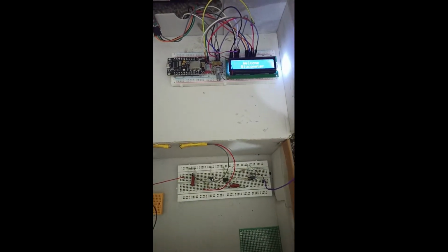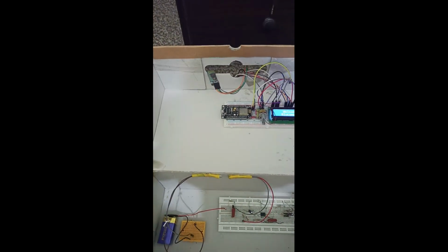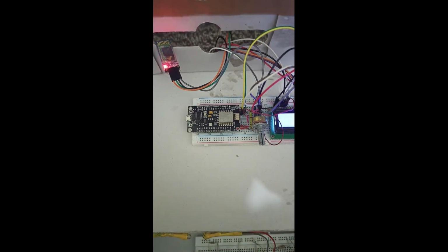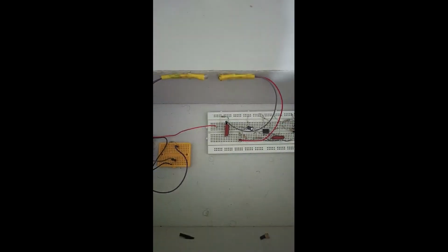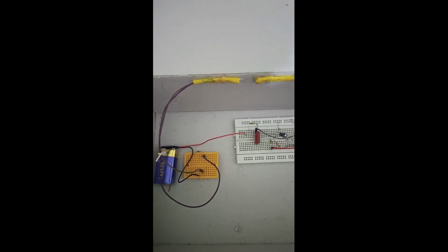Hi, this is the hardware circuitry of our project, powered up with a laptop. The main components of our project include the Wi-Fi based NodeMCU microcontroller chip, an LCD along with it which displays the data sent by the app, and the Bluetooth sensor. The other part of the project is powered up with a simple 9-volt battery.